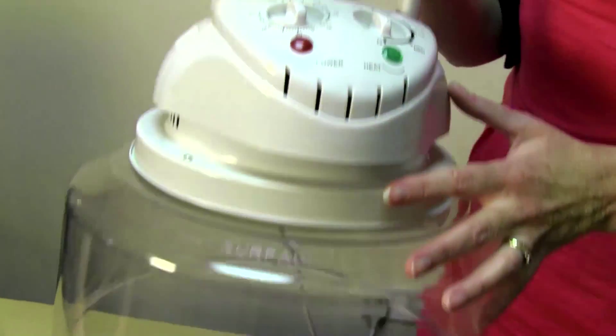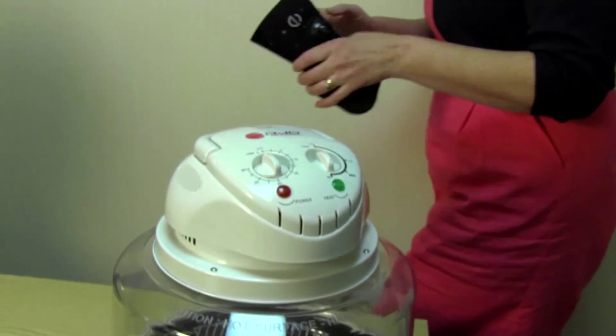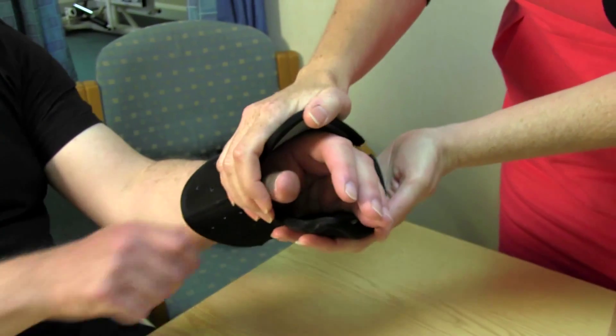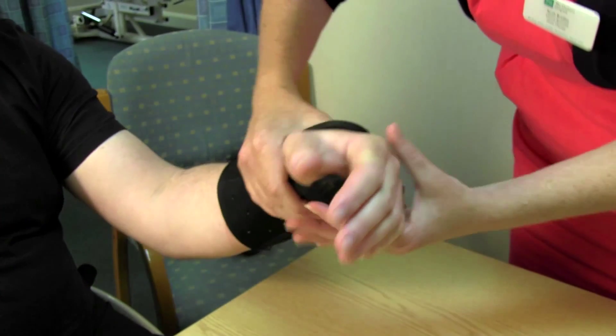It's very light. It's the only brace that currently exists, that I'm aware of, that you're able to get wet and still keep in situ. It's a splint that wraps around the entire circumference of the wrist and hand, and by its nature of doing that, the support itself is very rigid and robust. One of the principles of splinting is that the more three-dimensional your splint is, the more likely it is to provide good support.